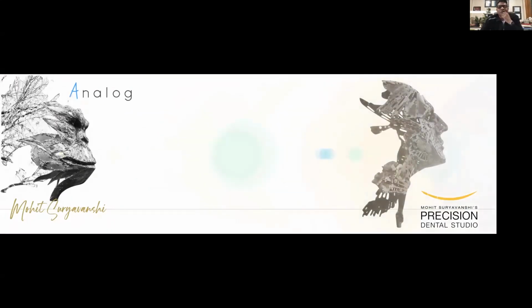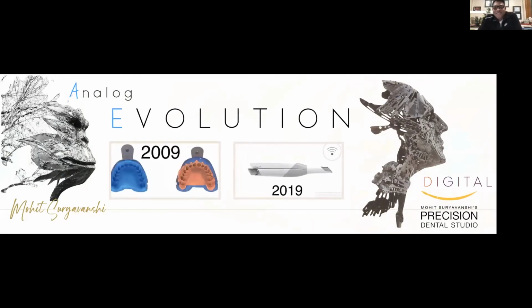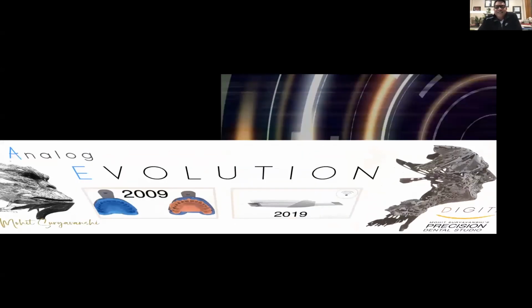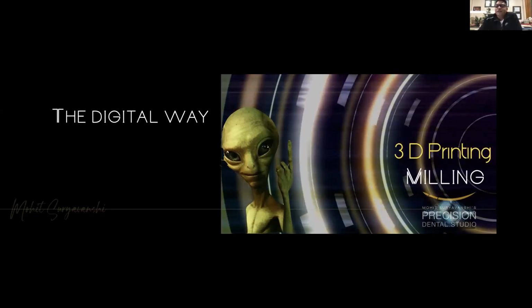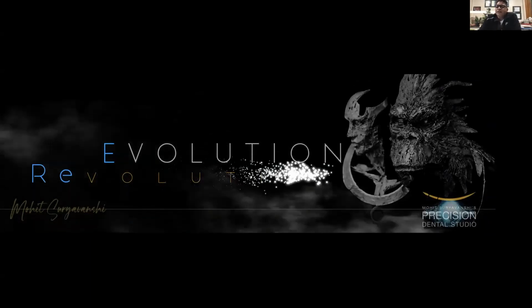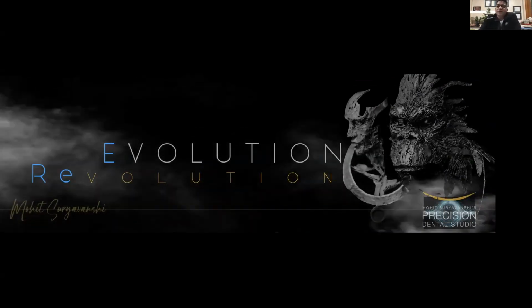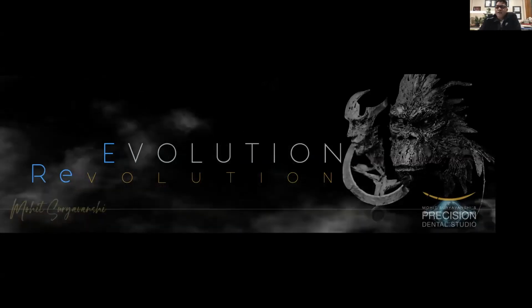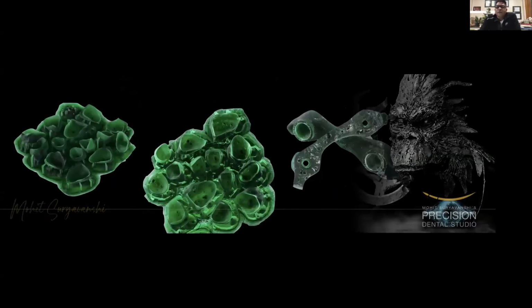And now there is a revolution after this evolution. It's more of the milling, the digital way, the 3D printing, everything has come in. Life has become easy, if you feel so. But if you're not sound in the analog way, then it's really not going to help you out. I have seen a lot of labs having really sophisticated milling units and 3D printing units, but somewhere they lack the analog way, and that's where the final product is not up to the mark.